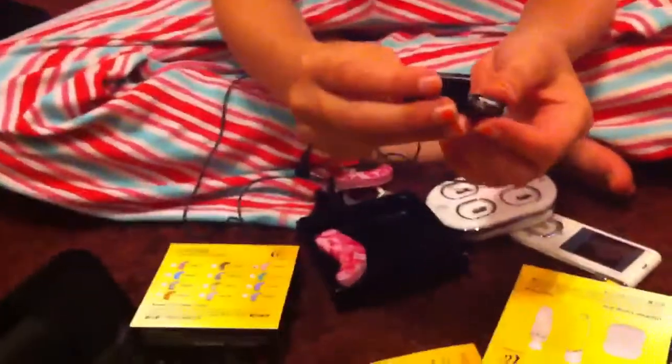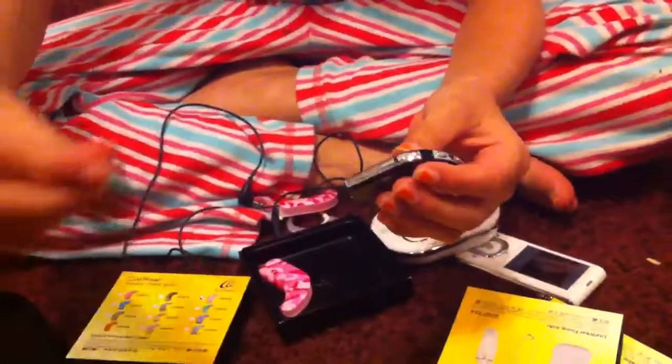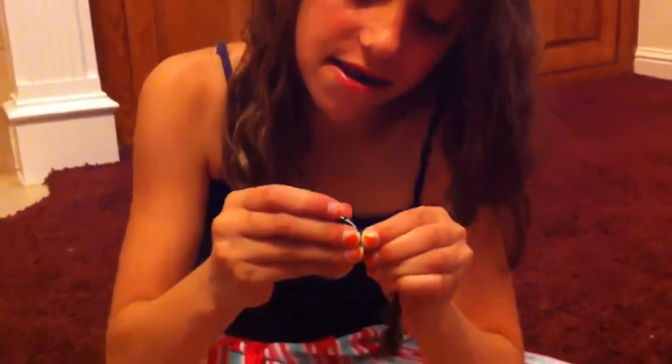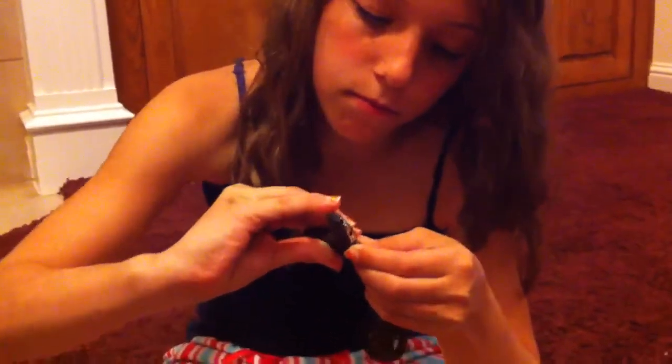Now I will show you how to put it together. Twist the battery on — there you have it. It's also water resistant.